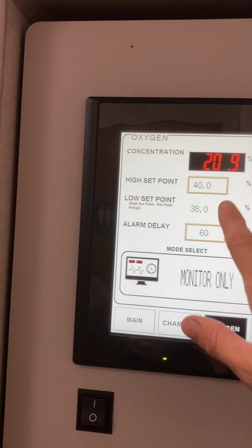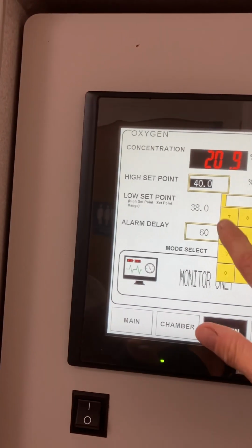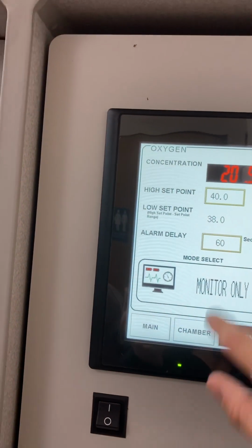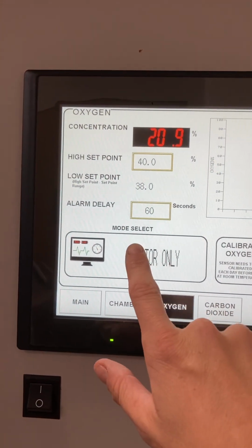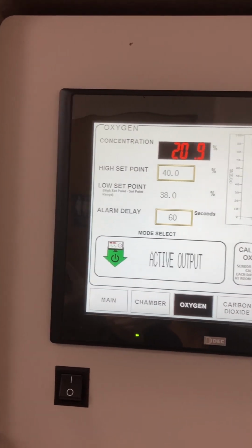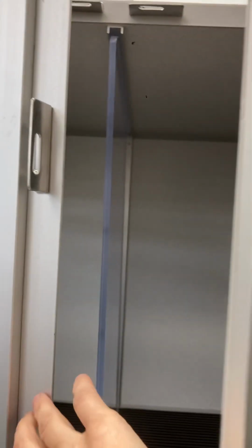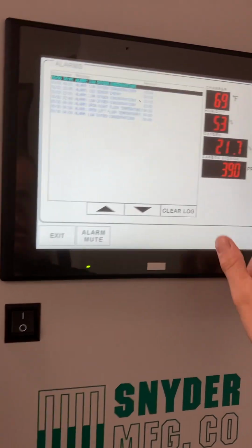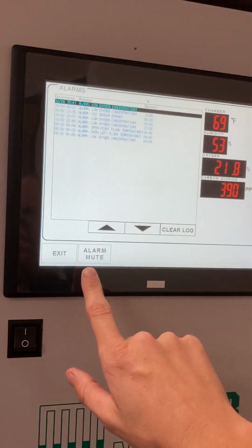The next thing you'll do is pick your set point. 40 is typically where we start. Go ahead and go from there. And then finally, in the mode select, go from monitor only to active output, which goes ahead and puts oxygen into the box. At this time, you can go ahead and set these doors. Oxygen alarm is totally normal. It's just saying that the concentration is low. The alarm pops up. You can just press mute. So go ahead and shut your doors.